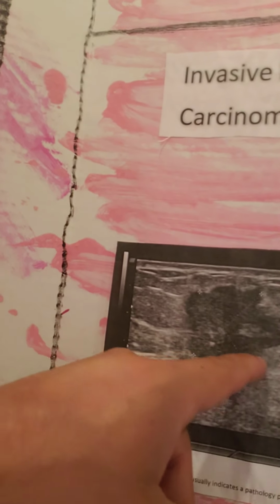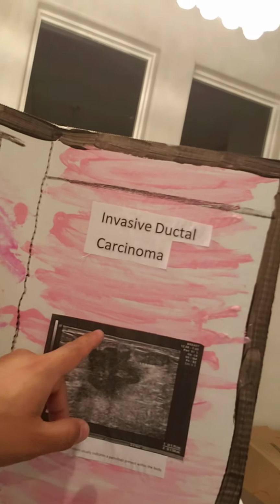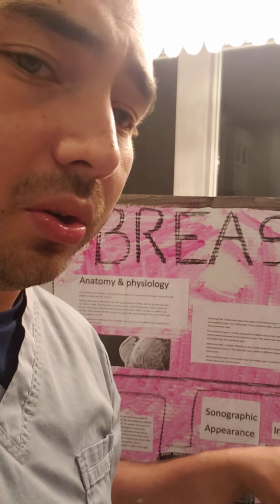Right here, as you can see, all the edges, they're not like the fibroadenoma, where it has a clear edge all around. This one has edges like a peak, and there's no smooth, like it goes up and down and side to side and then all the way around. This is a good indication that it's an invasive ductal carcinoma. Something like this would need a biopsy to make sure at what stage, or if it's spreading and how far it has spread.